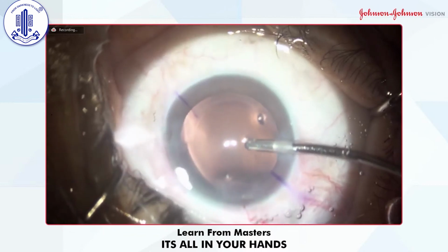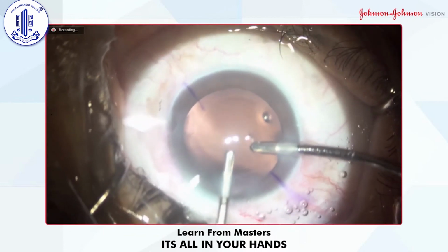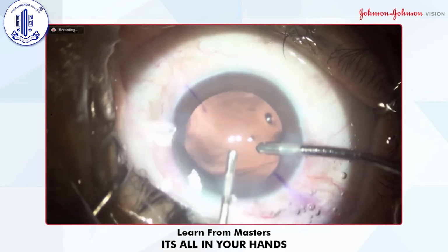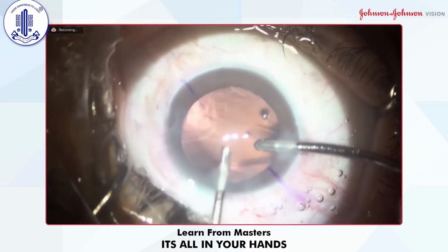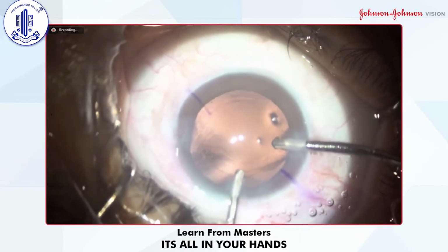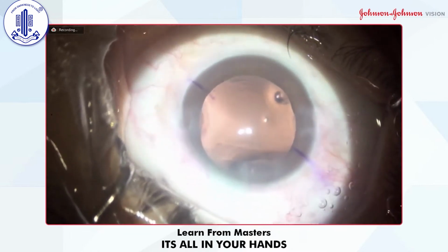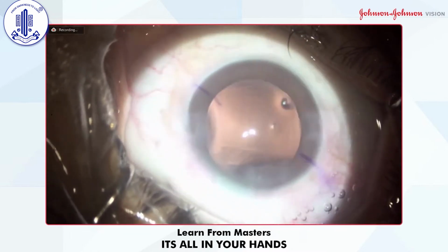I like to inject in Viscoat, under Viscoat. Stop. Irrigation is stopped now. Injecting the visco. Keep the chamber filled all the time. More or less all the steps of IOL.